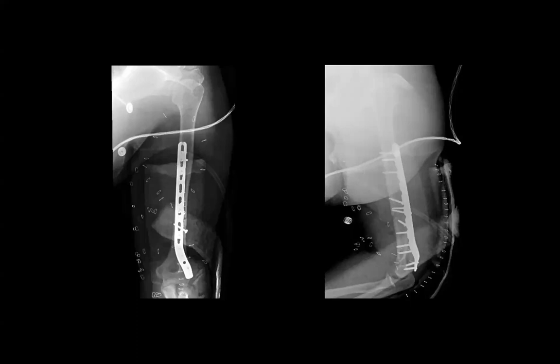Well, did you preemptively leave a little room for like an internal joint stabilizer in there? Using an internal joint stabilizer is an option. But if you use that plate and you put the screws across the entire capitellum, you wouldn't have been able to put that joint stabilizer. Is that just a coincidence? No, it's just a coincidence.